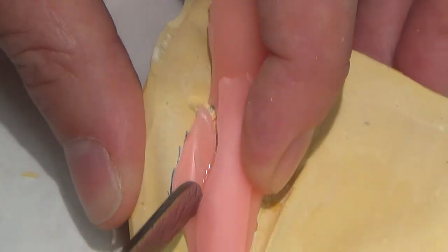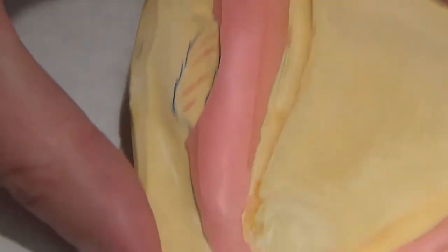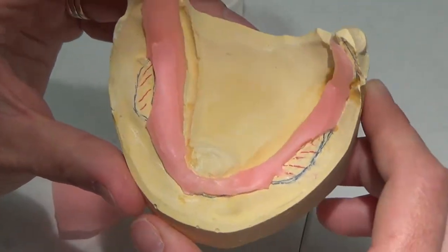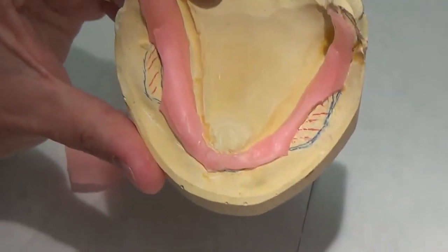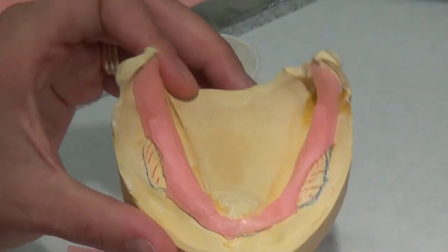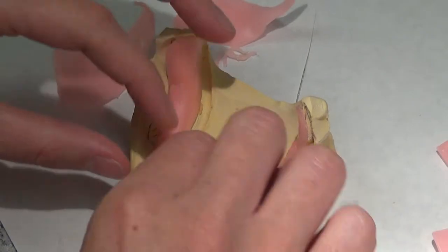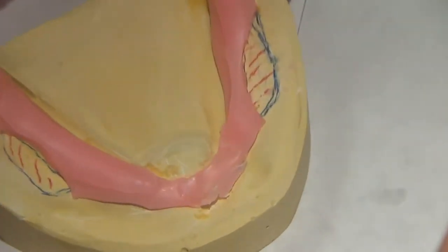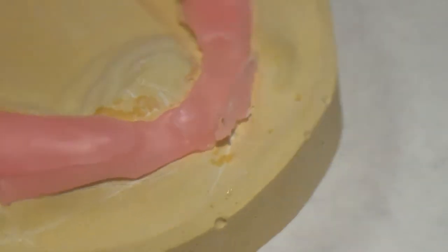Same thing on this side. So it's going to look something like that — super little, right? This is tiny. It's a good thing my tray is going to come out to here and not stop there, otherwise this would be really difficult to manage. I'm going to flame just a little bit of wax in there.